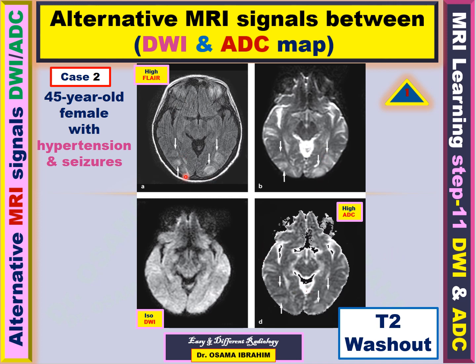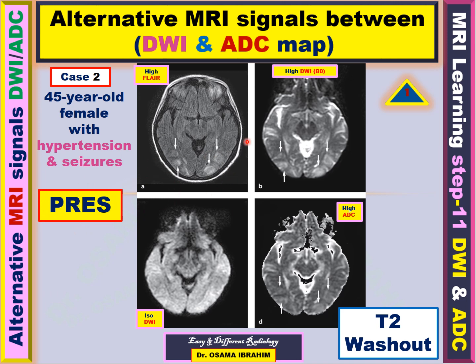This is confirmed by the FLAIR MRI sequence, which also appeared high in the posterior occipital lobe. From the history, location of lesions, and edema characteristics due to T2 washout, PRES — posterior reversible encephalopathy syndrome — is highly suggestive, and this case was diagnosed and confirmed as PRES.